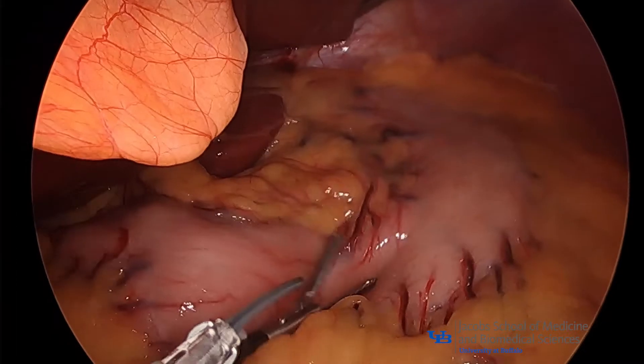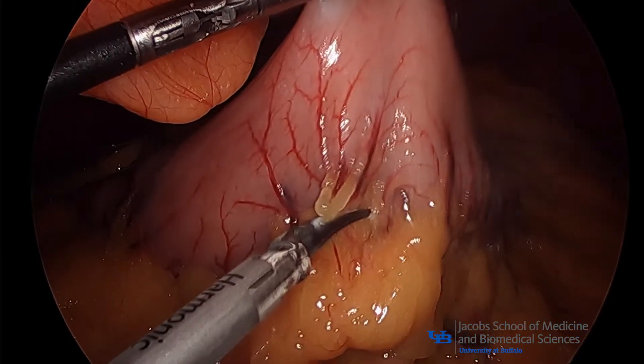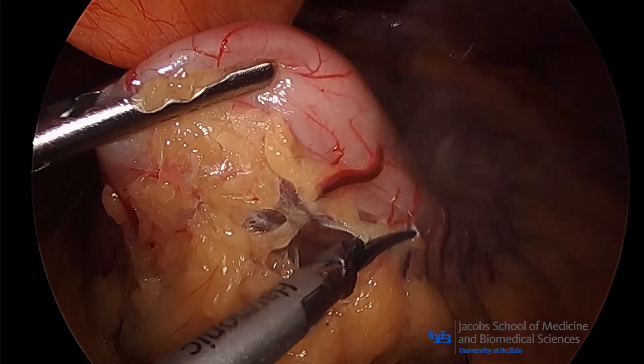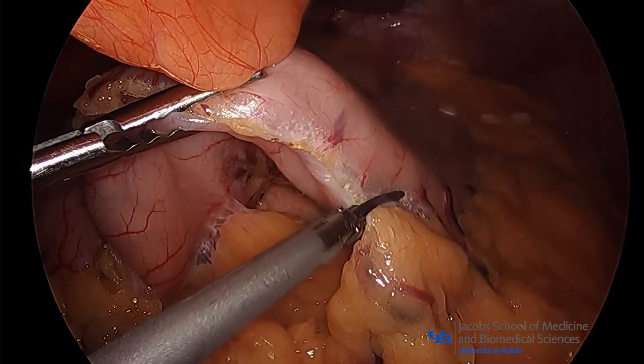A Nathanson liver retractor has been previously placed to retract the left lateral segment of the liver. The short gastric vessels are first taken down using the harmonic scalpel from 6 cm proximal to the pylorus to the angle of His.